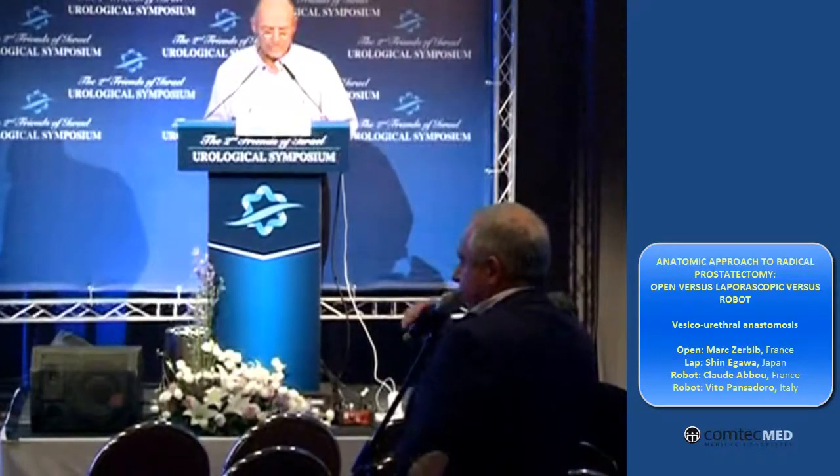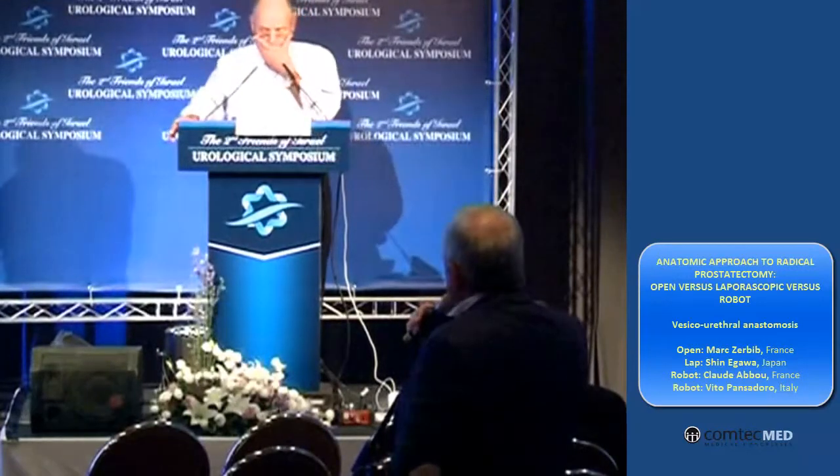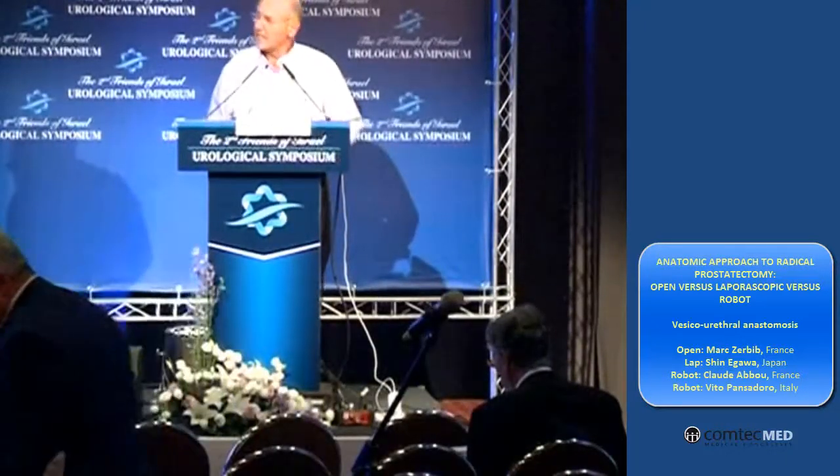And you take it out from the surgical field. The prostate usually is actually enucleated from the bladder neck — there is a very nice avascular plane between them. And if it's difficult to separate, it might be because of penetration of cancer, then you have to take out the entire bladder neck.